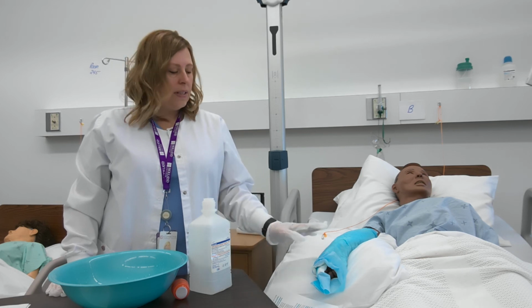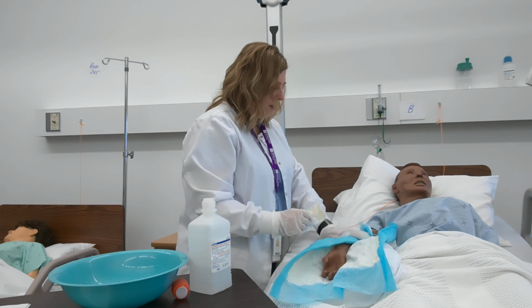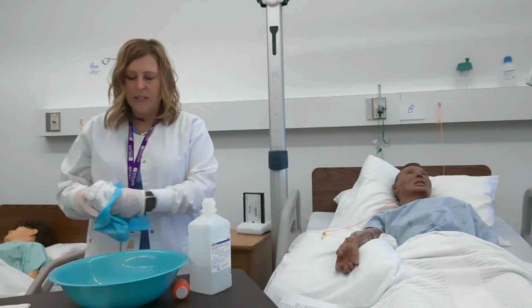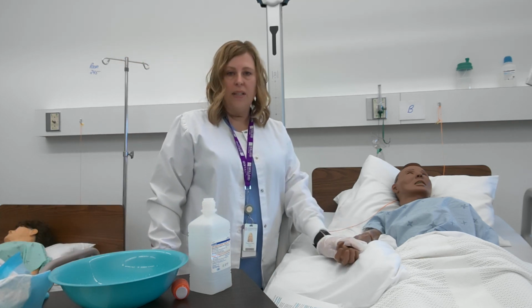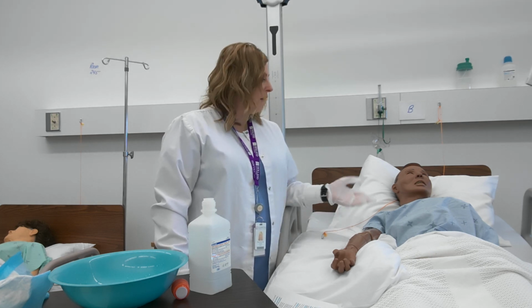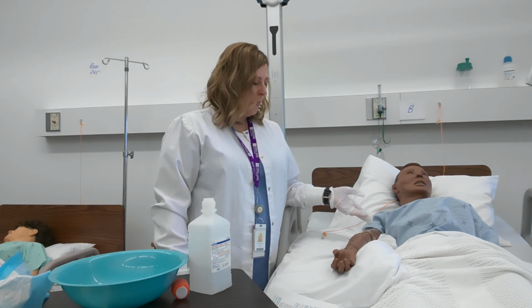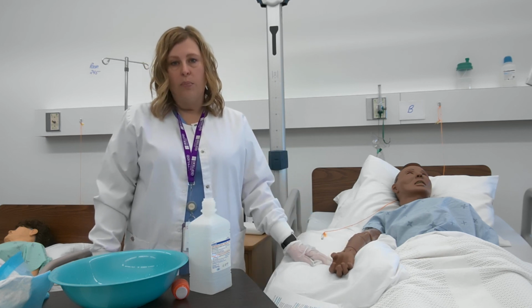Once the treatment is complete, I'll take this off completely, dry off the arm, and do a reassessment of that area. Again, I'm looking to see how well the treatment worked for what I was trying to do. Does that area look any better? Does the client complain that the pain is a little bit less than it was before? And then once I've done that, I'm going to document all of this in the interdisciplinary progress notes.